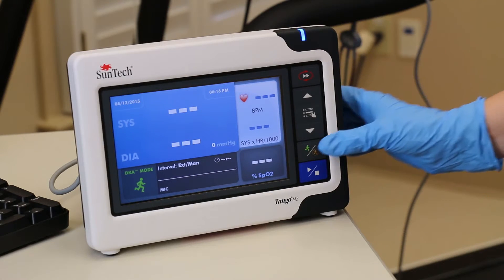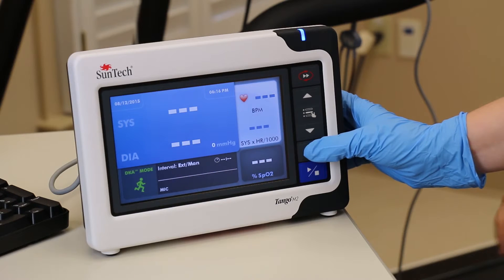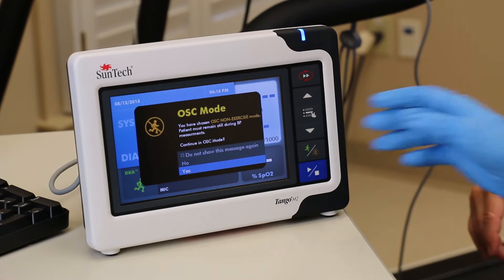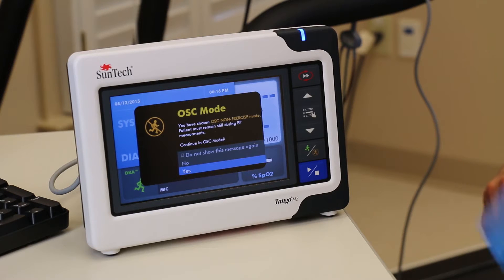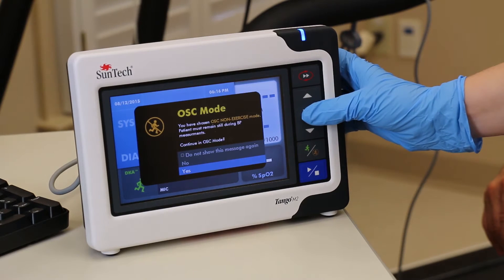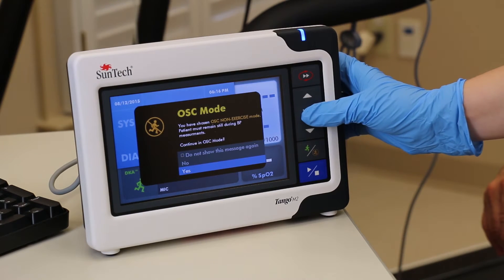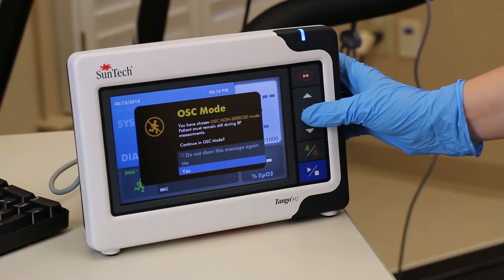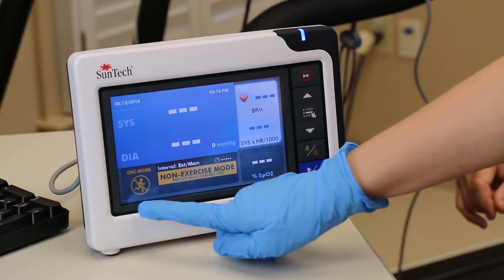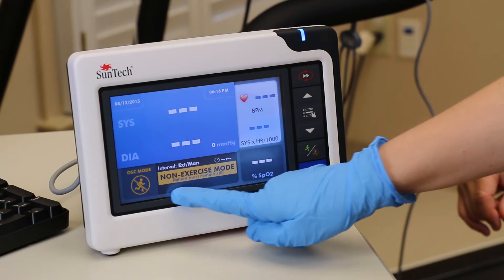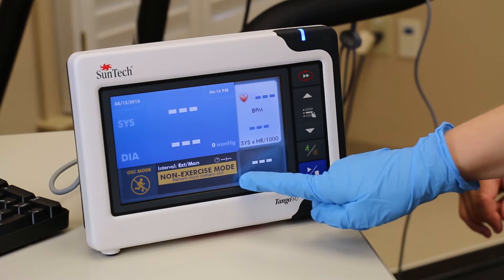Press the DKA OSC button to use OSC mode. The OSC mode message box will appear. Highlight Yes and press the Select button. Note that the K sound display window text is now orange to remind you that the Tango M2 is not in DKA mode.